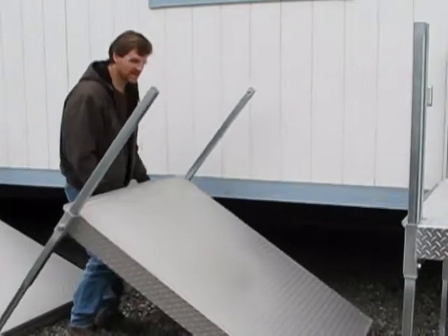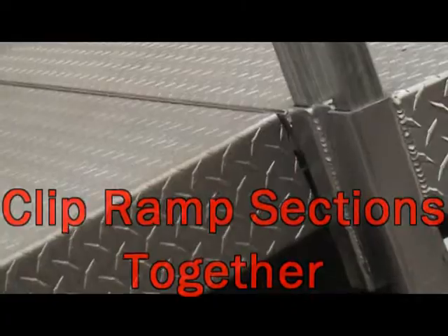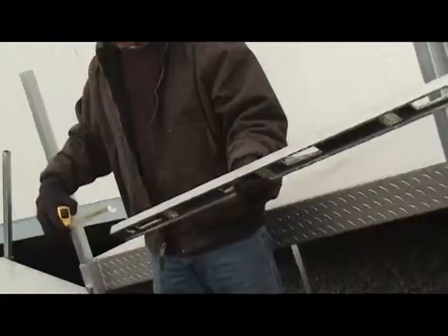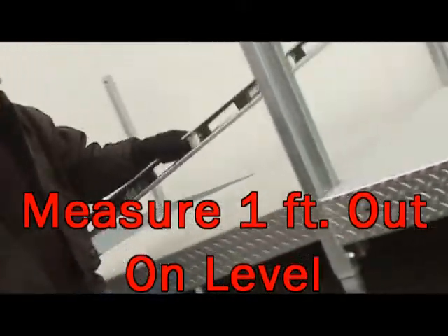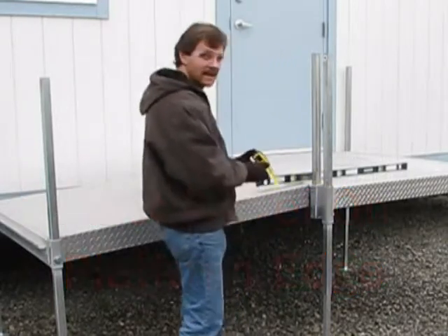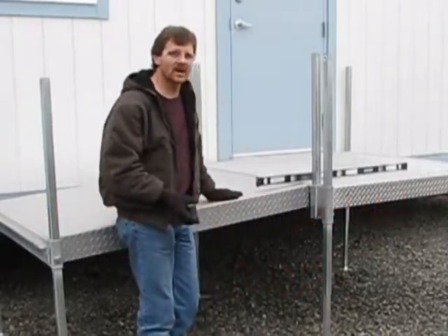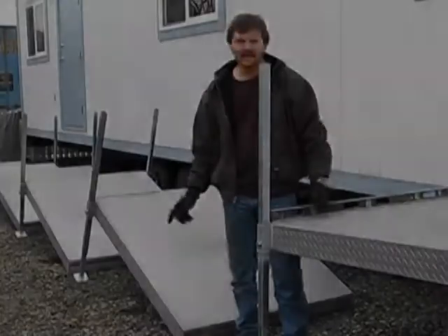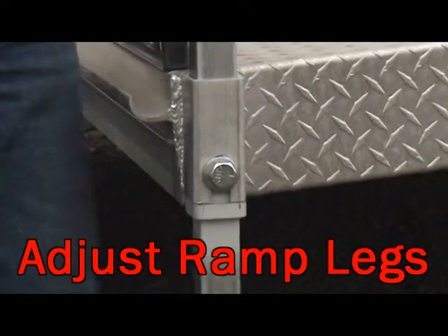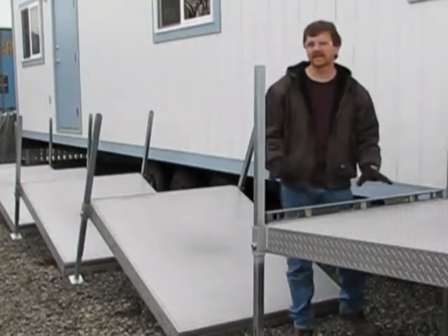At this point we're going to install each ramp section. It's best if you have two people to do this operation. Take a level and put a one-foot mark on it. Make sure your platform is level, then put that one-foot mark at the edge of your platform. Take a tape measure and measure one inch down — that will give you a 1-in-12 pitch, which is the maximum allowed for ADA requirements. Once we've set our 1-in-12 pitch on the ramp sections and adjusted our legs, we set a level across the face of the ramp and adjust the following leg. Then we're ready to attach the next ramp section.